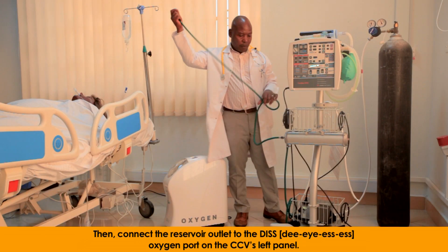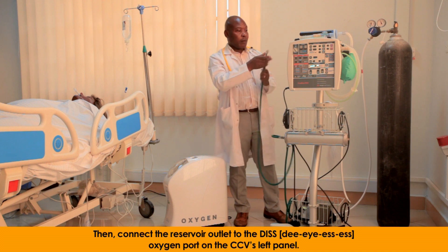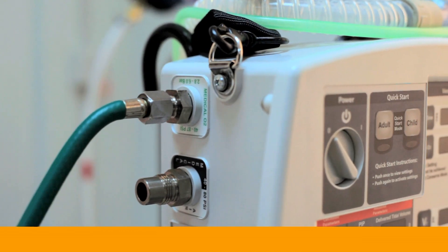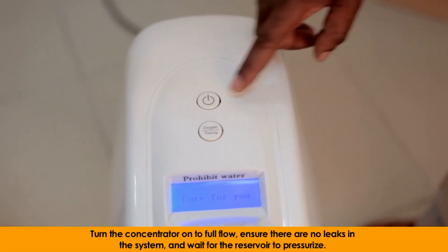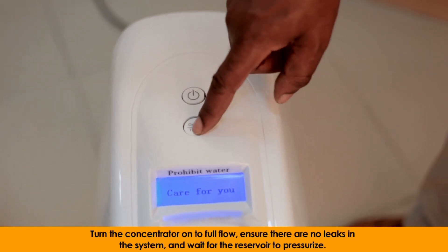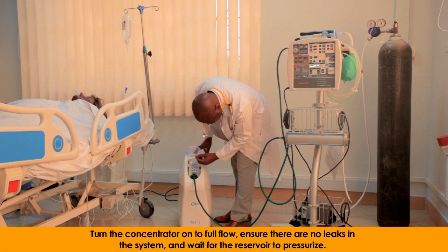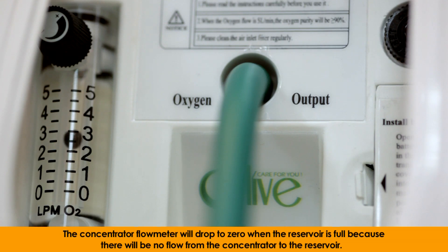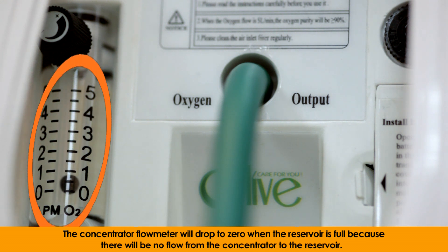Then, connect the reservoir outlet to the DISS oxygen port on the CCV's left panel. Turn the concentrator on to full flow, ensuring there are no leaks in the system, and wait for the reservoir to pressurize. The concentrator flow meter will drop to zero when the reservoir is full, because there will be no flow from the concentrator to the reservoir.